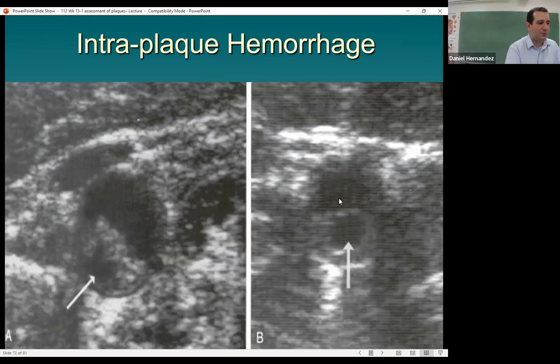If you're the first one finding them, usually like for a carotid scan, it's done as a pre-op thing for cardiac surgery, and you would need an indication, so they might have some stroke symptoms. So they may have had a TIA or even a CVA, and they would want this to see if that CVA or TIA was caused by some of these plaques.